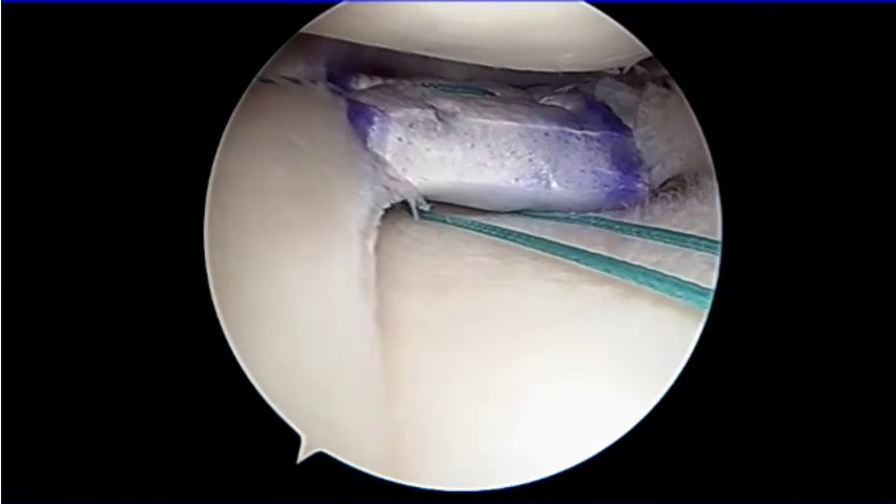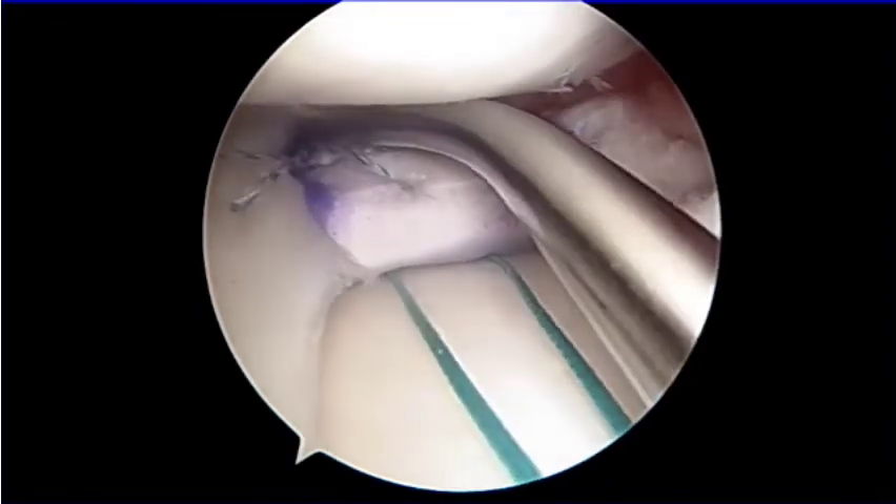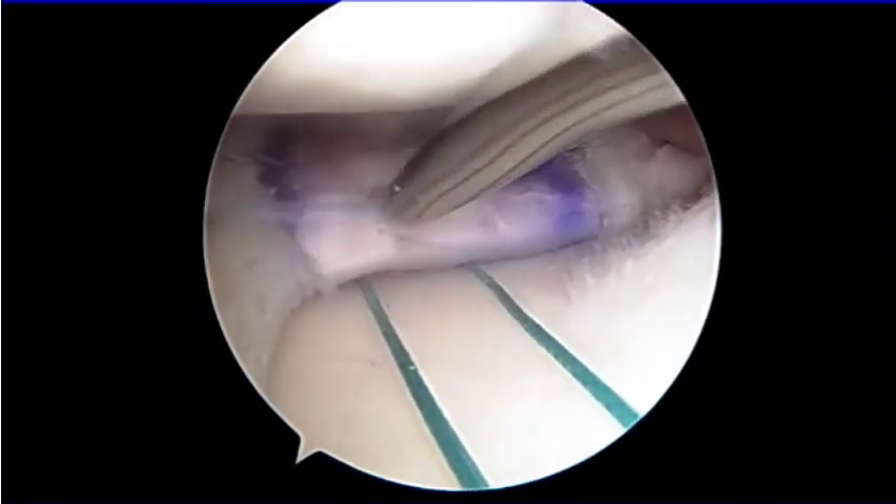We recommend that suture tension should be regulated through the medial side of the meniscus.